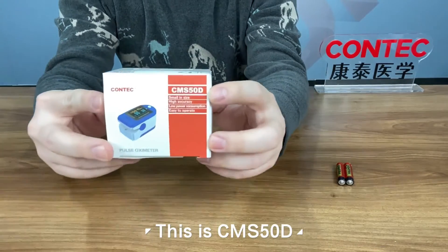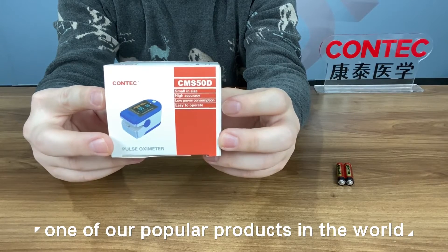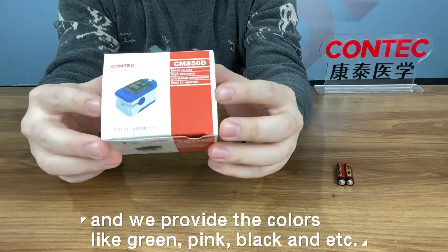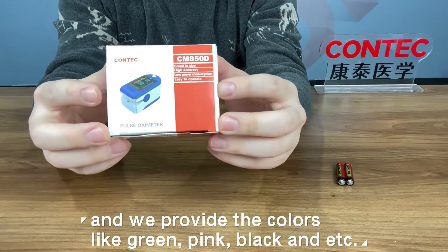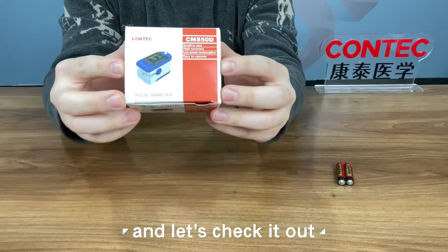This is CMS50D, one of our popular products in the world. It is multi-color selectable and we provide the colors like green, pink, black and more. Today we bring a blue one here and let's check it out.